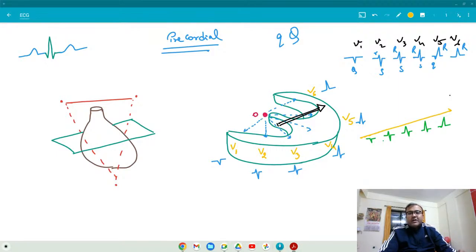We have also learned about the QRS complex. In which case, what do you think? In all the cases, are we seeing that QRS is positive, or was there any negative condition also?